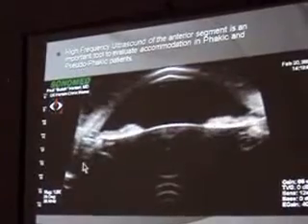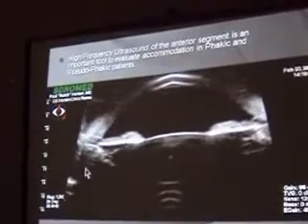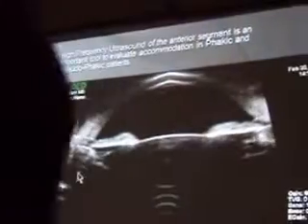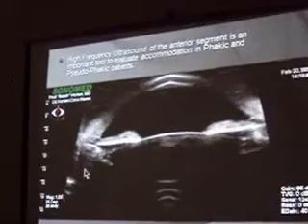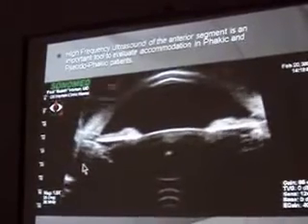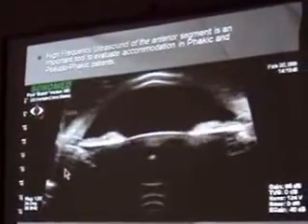It's not only closing or making that ring smaller, it's pushing anteriorly, together with the whole anterior uvea. There is an iris bowing, there is a crystalline lens change in shape, and there is a clear shift of the ciliary body inward and forward, which is very understandable because it's following the anatomy, following the sclera, where it is inserted or connected.